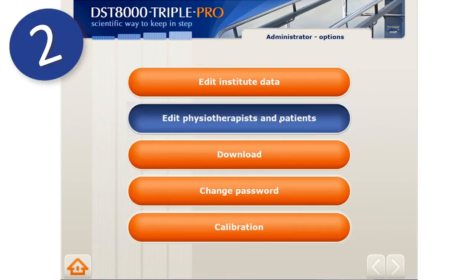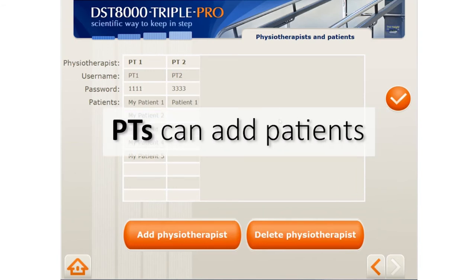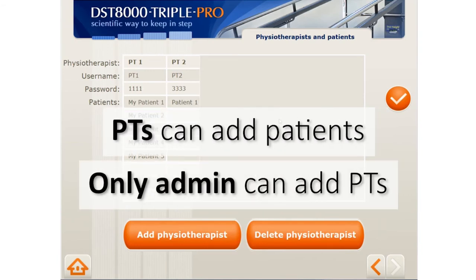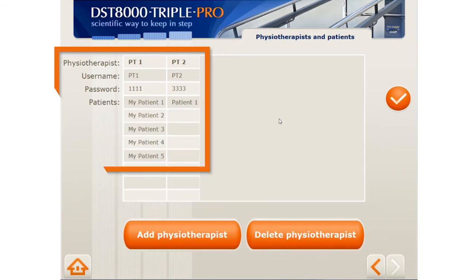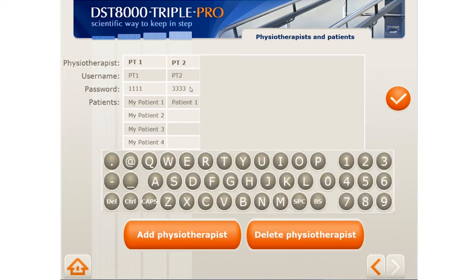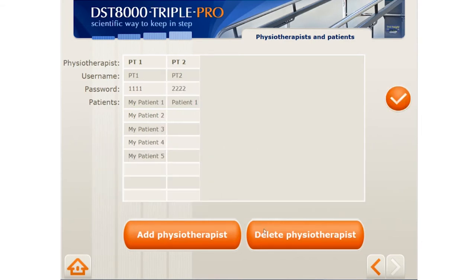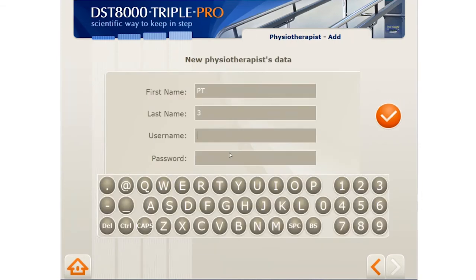The next step is to add or edit PTs. Please note that while all PTs can add their own patients, only the administrator can add PTs. You can see a table of all existing PTs with their assigned username, password, and list of patients. Double-clicking on the details of a specific PT will allow you to edit his or her information. Click V to save all changes. You can easily add a PT by clicking here, filling their info and assigning them a username and password.